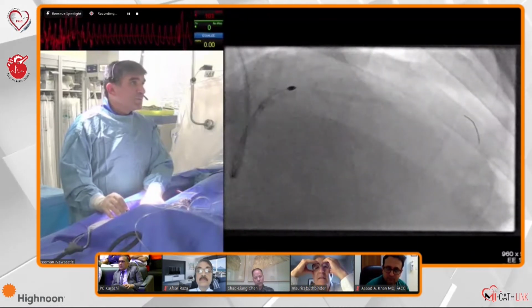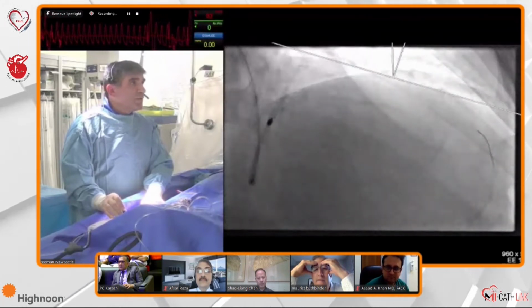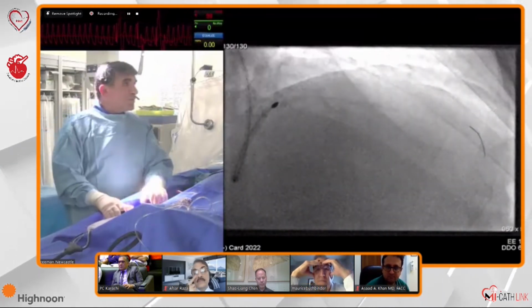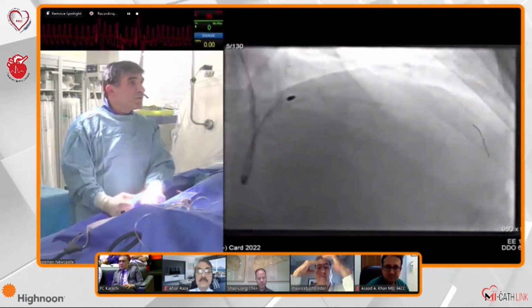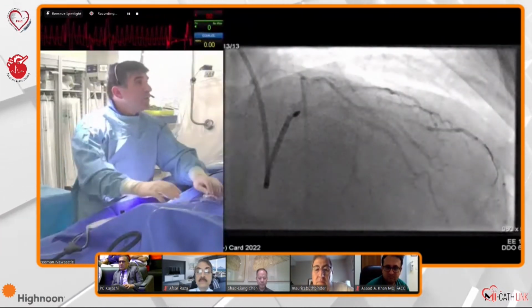Yeah, absolutely. It's the pecking technique, where you come to the lesion, let the burr work, and come out, and that will affect the calcium. Often, I think 15, 20 seconds is quite okay, unless you have a lot of calcium and a lot of problems. Okay, store that.